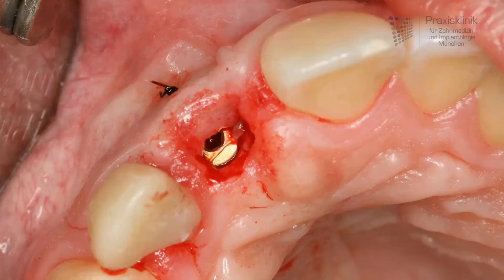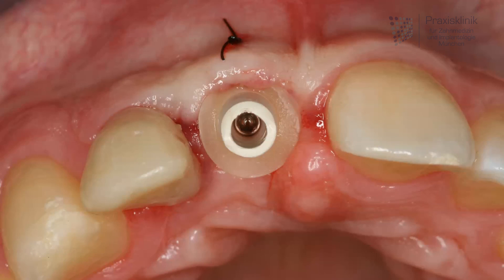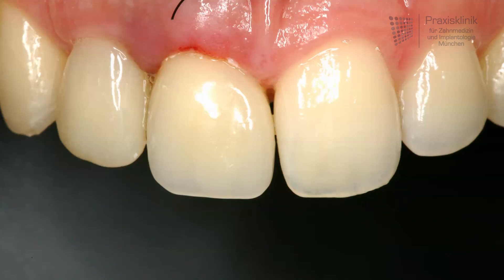In the next step, a temporary abutment is placed into the implant to allow additional modeling of the soft tissue. This type of abutment is screw-retained and the temporary crown is finally cemented. We have a very aesthetic temporary solution, and the situation should be in place for the next four weeks.